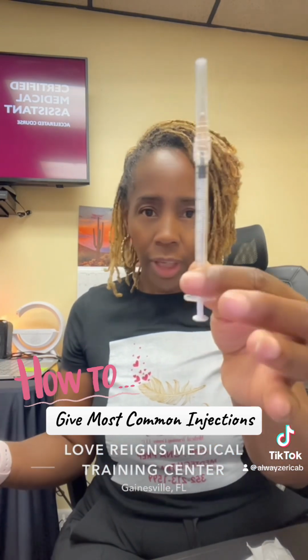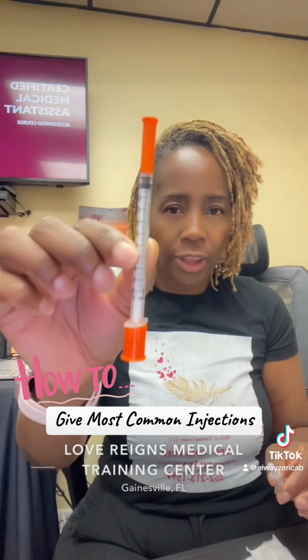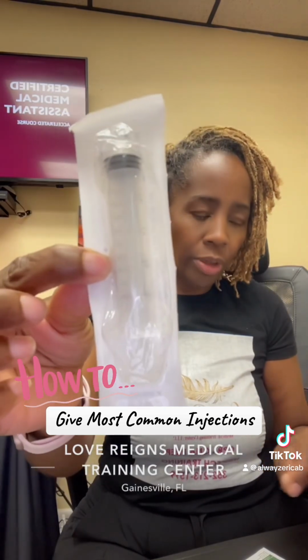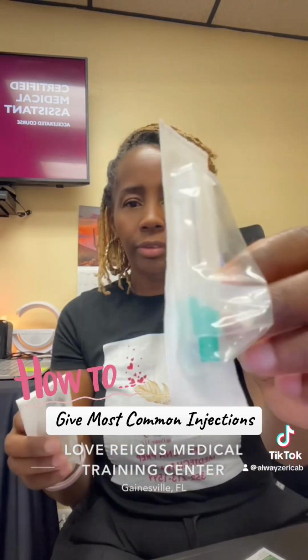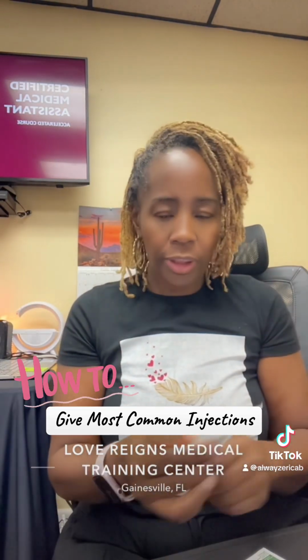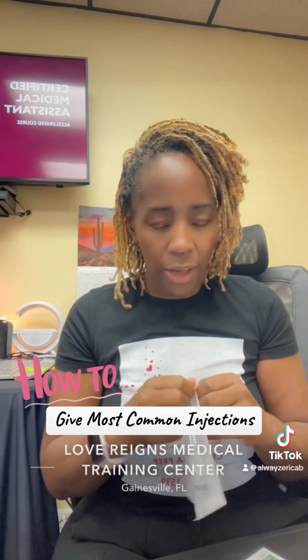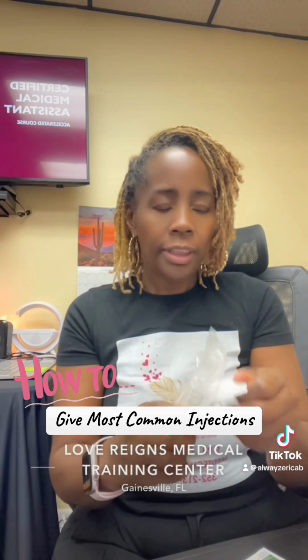This one is for insulin. And then the third one, this is the actual syringe, and this is the needle. I'm going to put this together, but this would be your intramuscular injection. IM is how that is usually referred to. It's intramuscular.